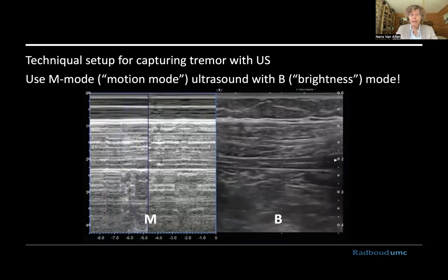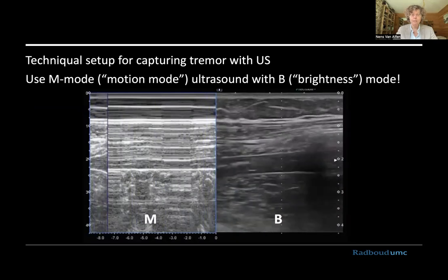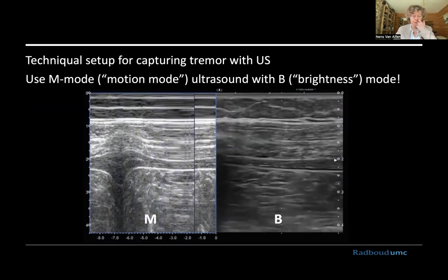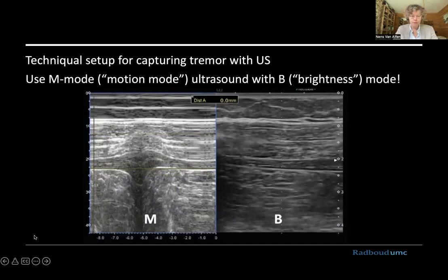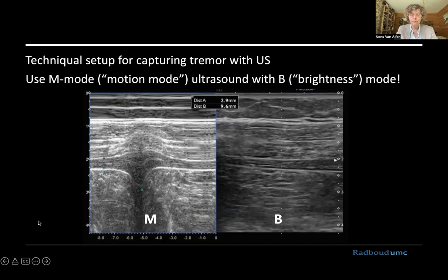So you could also add something more basic to the standard B mode image of movement. B is for brightness, and you can add M mode, and that is motion mode. It's present on, I think, every ultrasound machine because it was actually the first way of looking at this movement. So you can capture, someone is positioning an M line in the video here, right? At the edge of the diaphragm in this case, because this is diaphragm movement. And then if you start the M acquisition, you get what's called an M line.